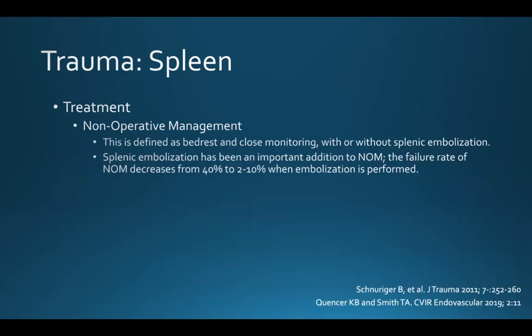This is defined as bed rest and close monitoring with or without splenic embolization. And embolization has been an important addition to non-operative management. The failure rate of non-operative management decreases from 40% all the way down to 2 to 10% when embolization is performed.